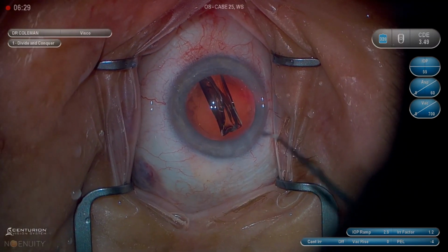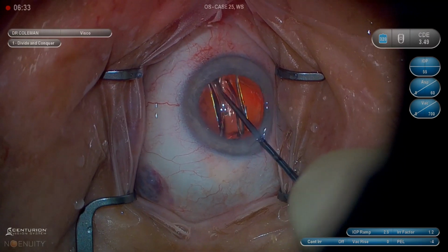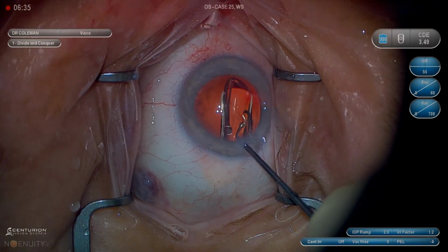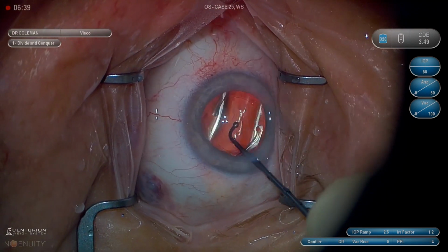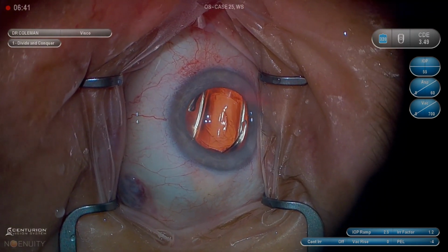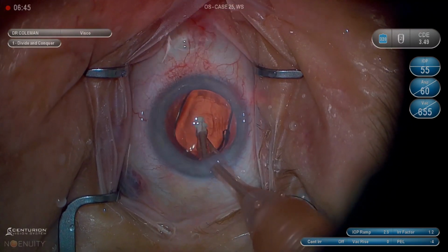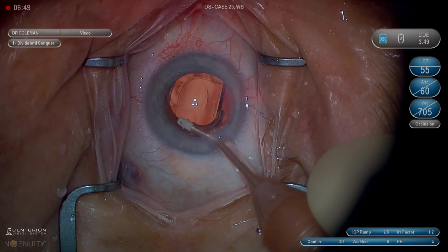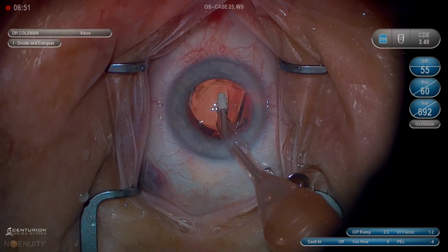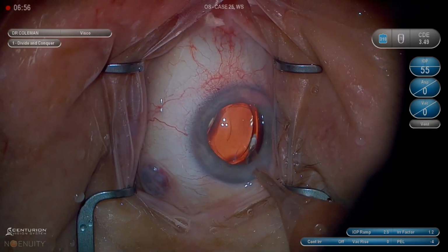Lens is in the posterior capsule. Remember, we don't have to keep pointing down once it's under that anterior capsular leaflet. Distally, I'm thinking about where these haptics are. I'm sure they're not going to block me when I want to go behind the lens. I'm rocking in the anterior chamber. This is basically floored. I've got the foot pedal to the floor, aggressively rinsing all the viscoelastic out. Now I'm going to nudge the lens over out of the way.